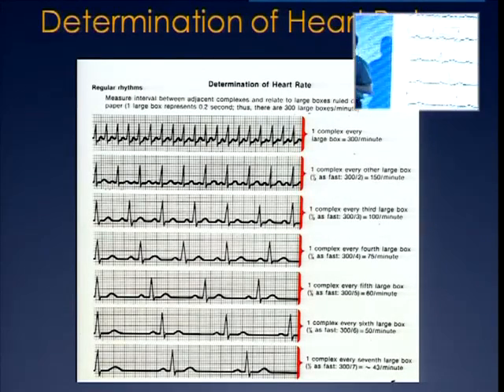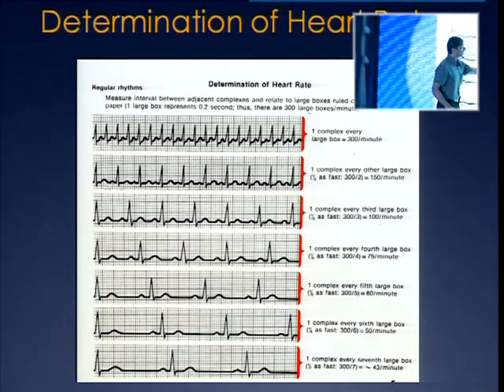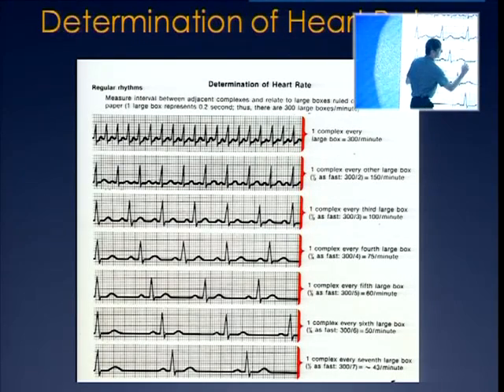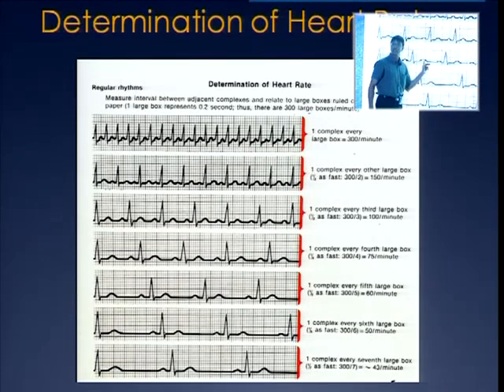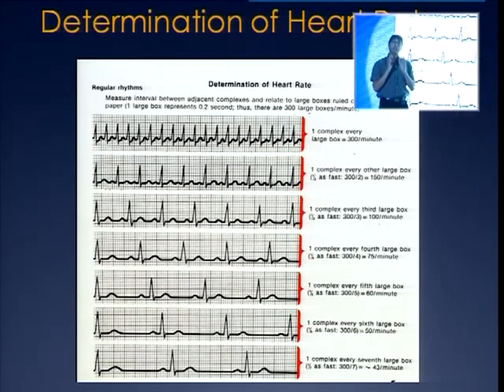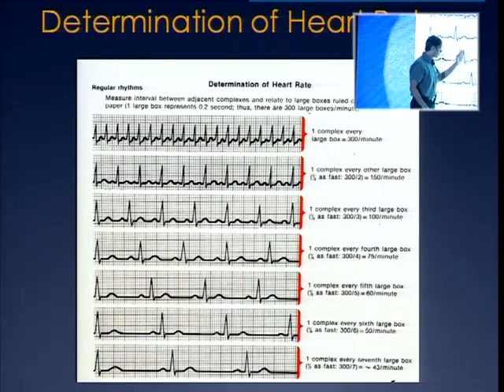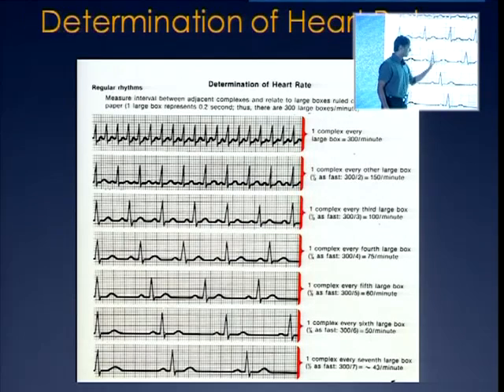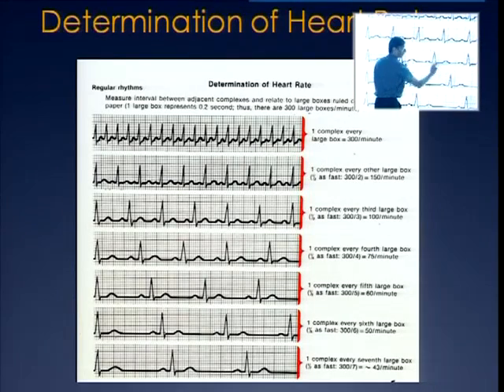Often when I start teaching nurses and you ask nurses to look at the ECG and you say, is this complex the same as that? And they say, yeah. But if I were to draw a building like this and another building like that, you'll immediately point out that this building is not the same as this. So there is an order that is to be followed when you interpret an ECG. You're looking at the P, the QRS, the ST segment and the T wave, and make sure that they all look the same morphologically.